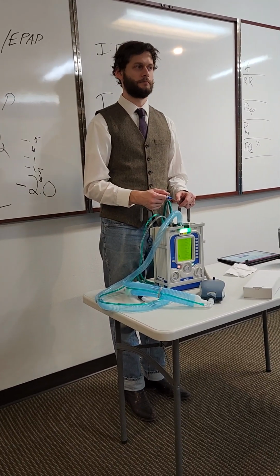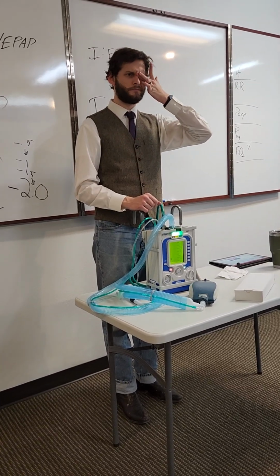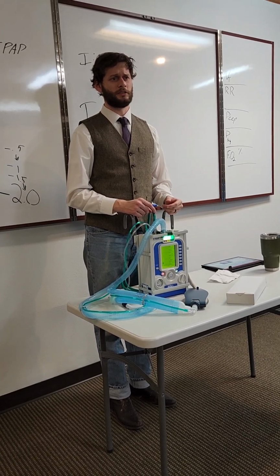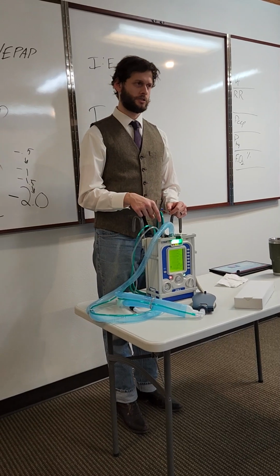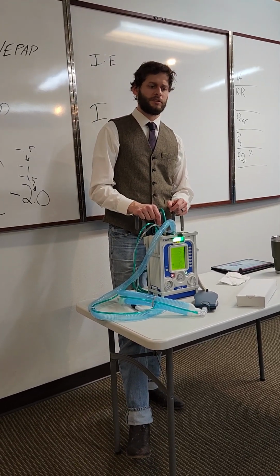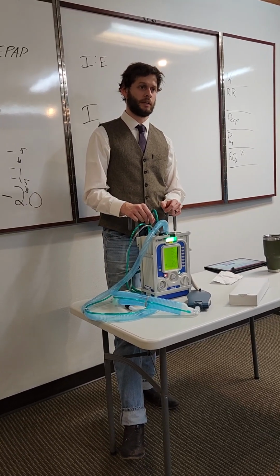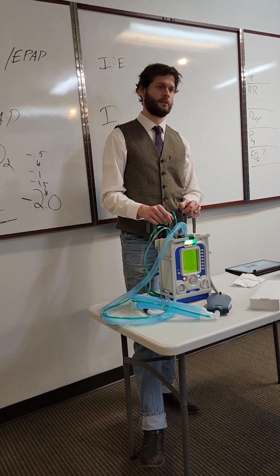Yep. And as I said, the battery on these things is outstanding. It's supposed to last like 6 months or something like that without being touched. It lasts pretty good. Every 10% of battery life on this is about an hour of AC ventilating, so potentially you have 10 hours of ventilation straight.